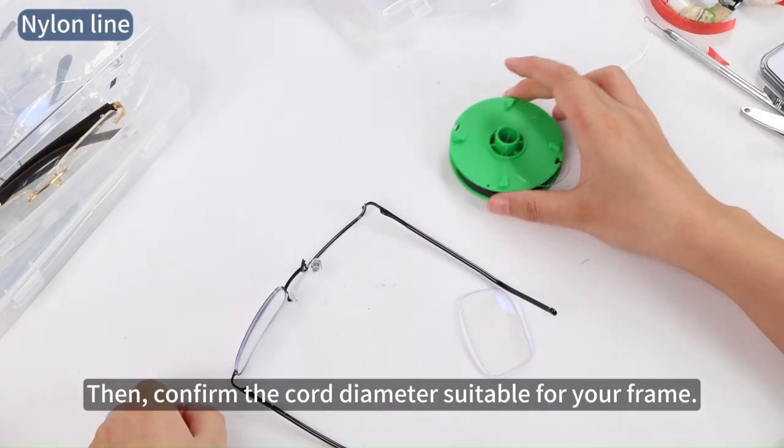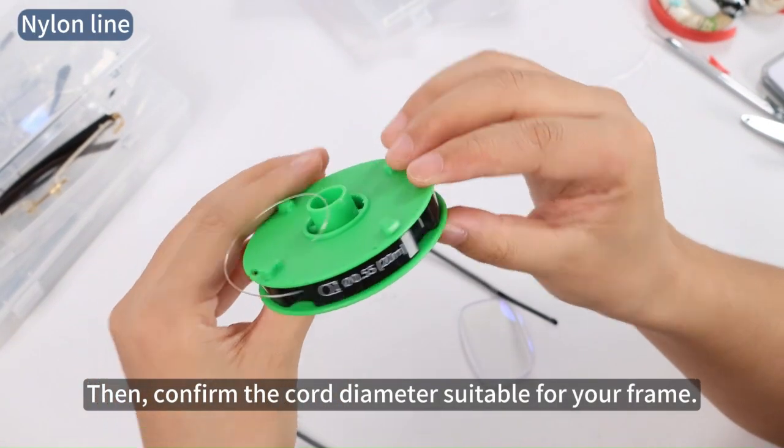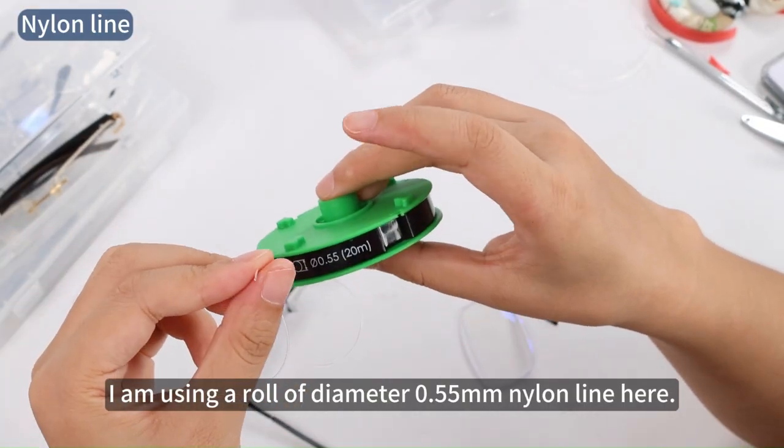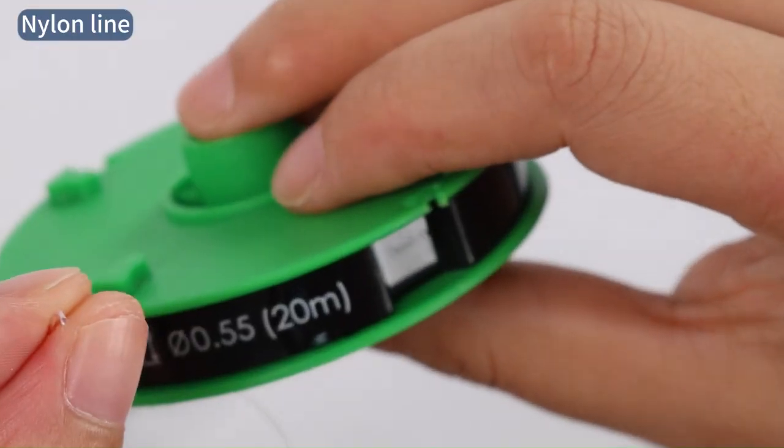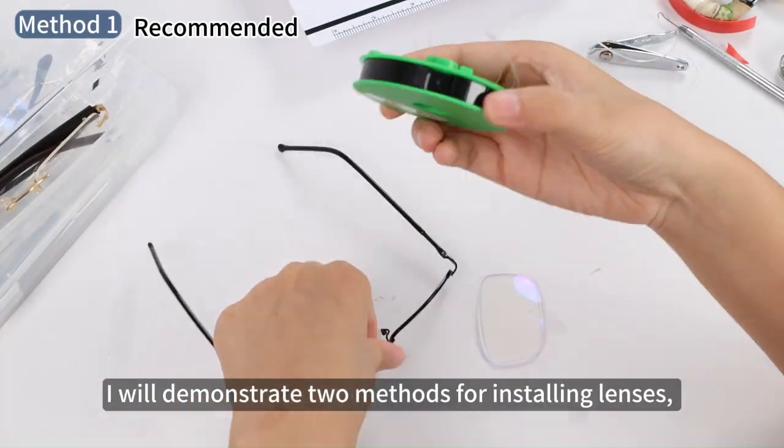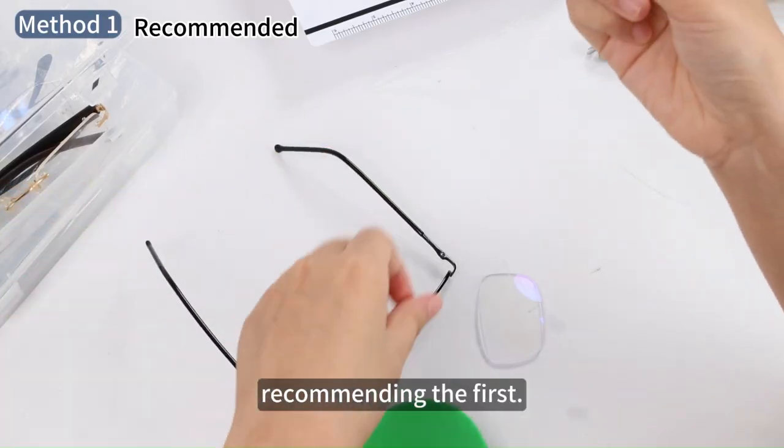Then, confirm the cord diameter suitable for your frame. I am using a roll of diameter 0.55mm nylon line here. I will demonstrate two methods for installing lenses, recommending the first.